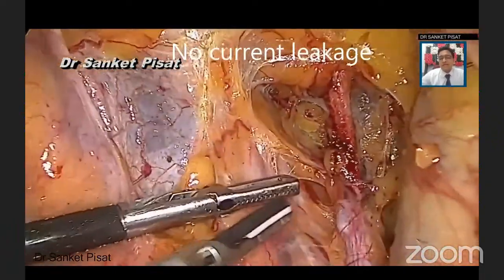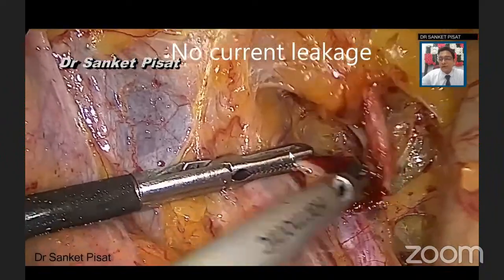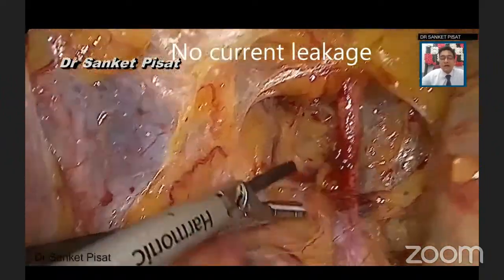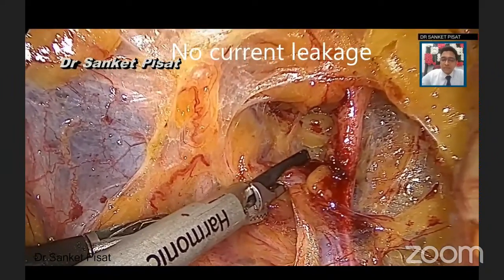At this point of time, you can see that all vital structures are close by. The ureter is running from here, and I am holding the uterine artery with my left grasper. And now I am going to coagulate this uterine artery, or better still, I am going to clamp or block this uterine artery using an energy source. At this stage, if I was using a bipolar, I would have to be doubly sure of no tissue touching anywhere along the instrument in this path, because you can see that though I have safeguarded the ureter with my left hand, part of this instrument may still touch the ureter, and if there is any current leakage, then it may happen that the ureter may get damaged.